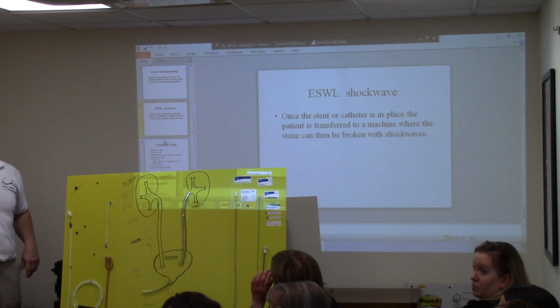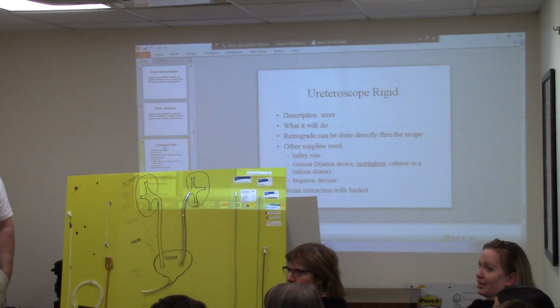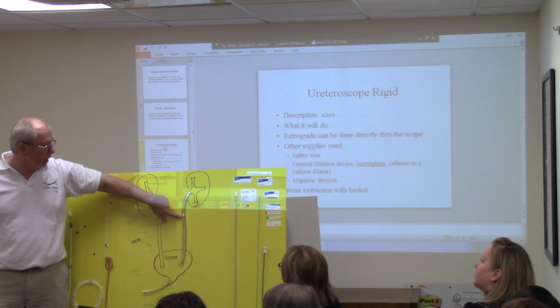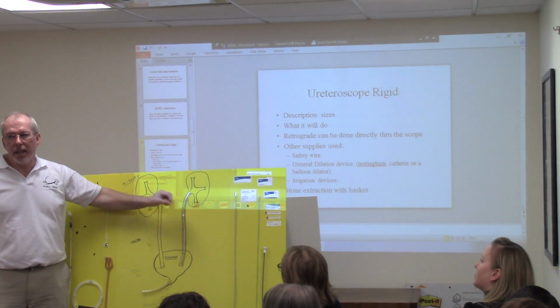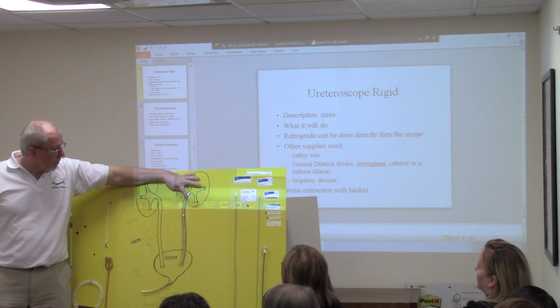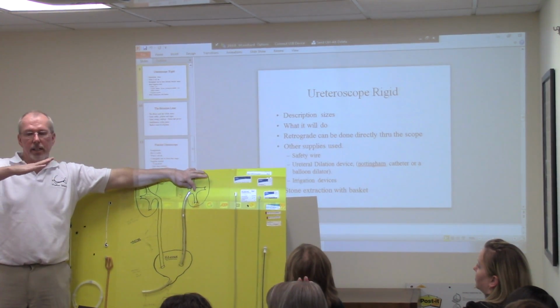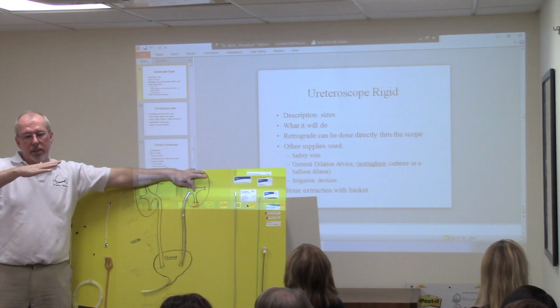Beth. Yes, sorry. So how often does the stone bounce around during treatment, and how do you keep track of it as it's moving? As we're shocking, if it's right here in the ureter and we're shocking that, no problem, it'll just stay there. And it'll gradually just kind of spread, and then you can tell that it's finished. But if you push the stone up here into the kidney, and now the patient is kind of laying reclined and tilted a little bit.